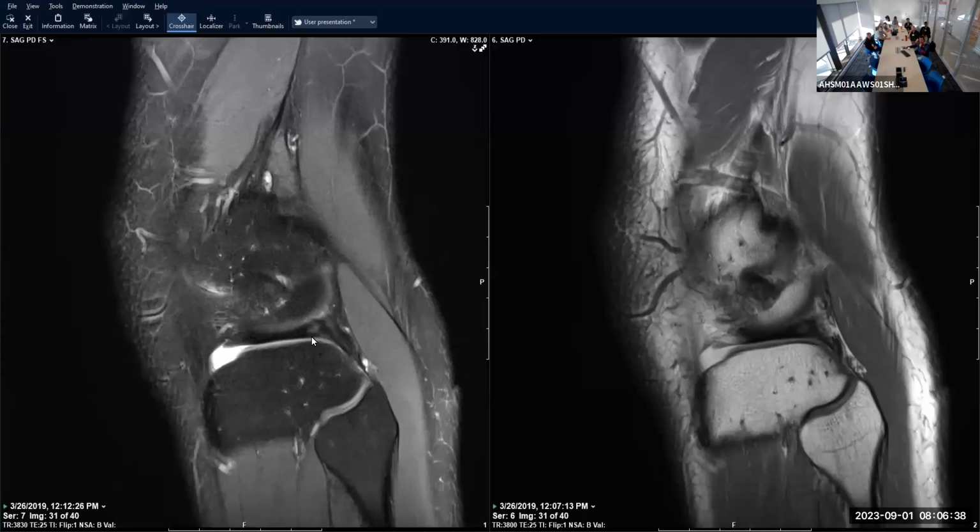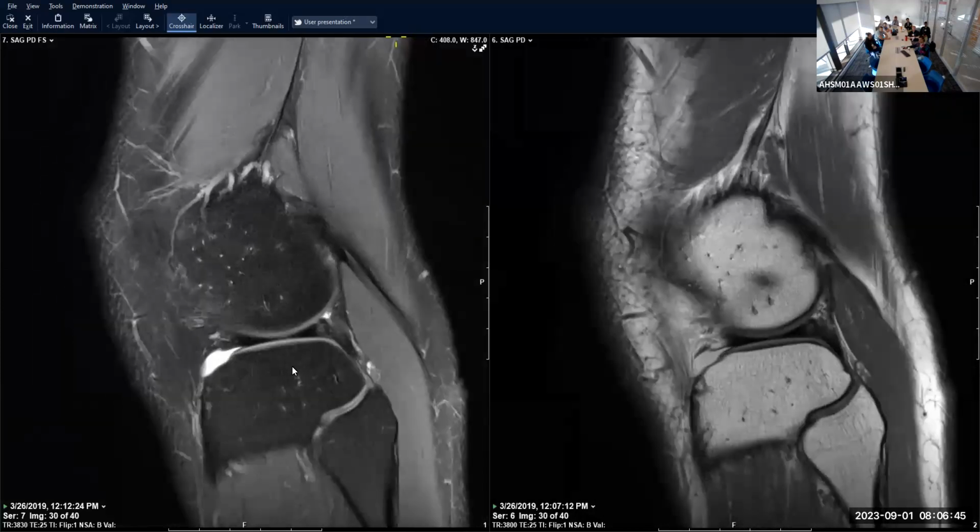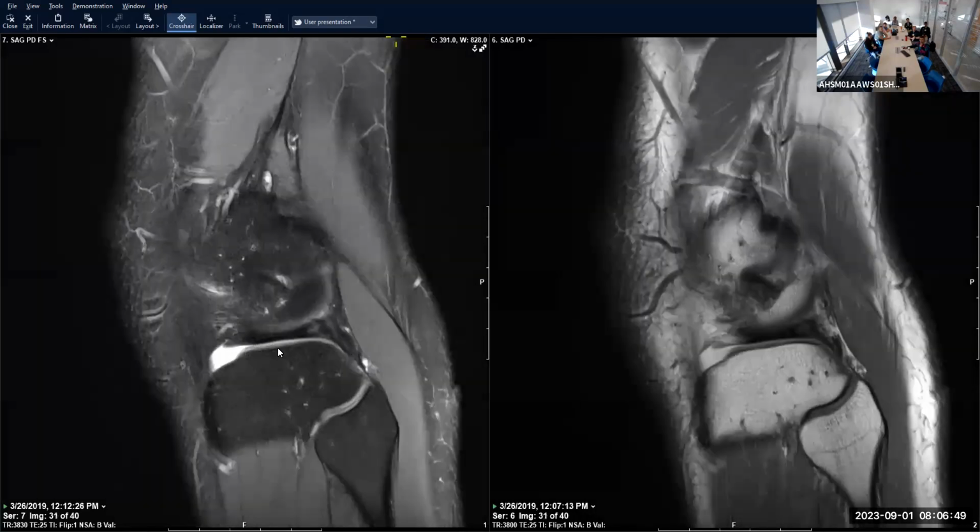Rule of thumb. Sorry. No worries. Yep, sometimes it can be a little bit ambiguous. There's definitely obviously ambiguous cases where we have to determine what we want to do, and we'll see some of those potentially today.